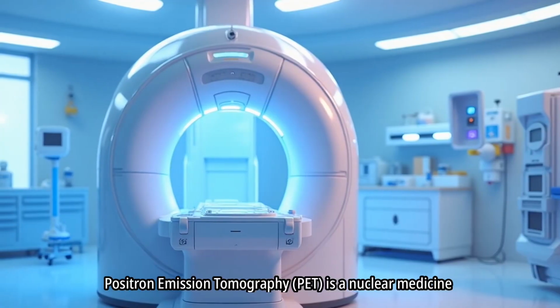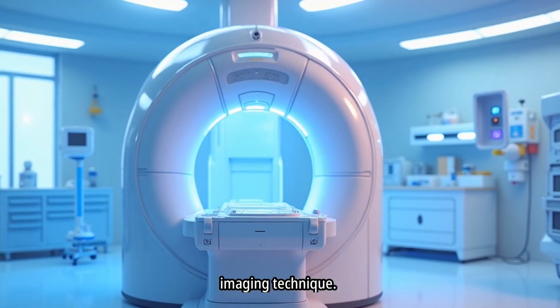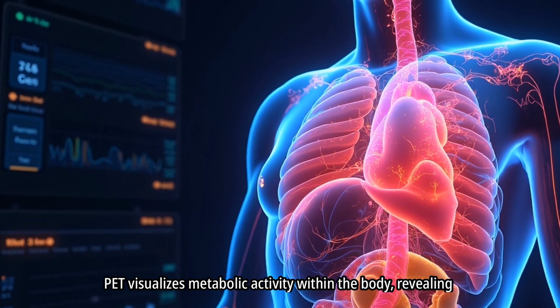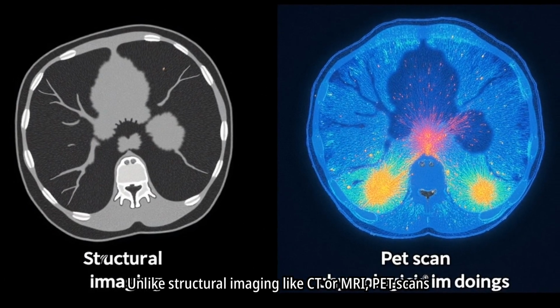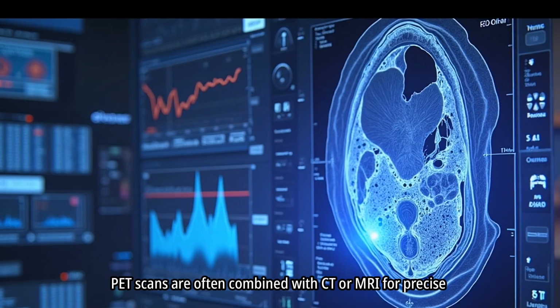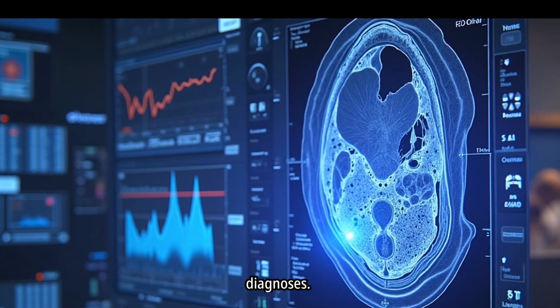Positron emission tomography, PET, is a nuclear medicine imaging technique. PET visualizes metabolic activity within the body, revealing organ and tissue function. Unlike structural imaging like CT or MRI, PET scans show physiological processes. PET scans are often combined with CT or MRI for precise diagnoses.